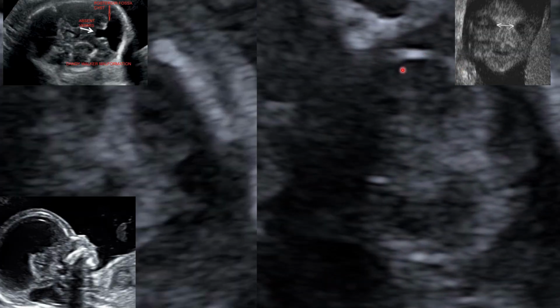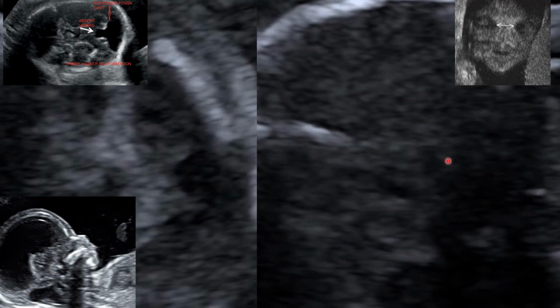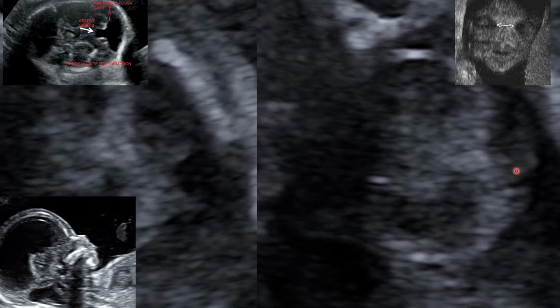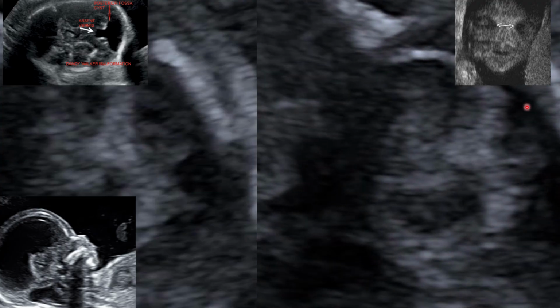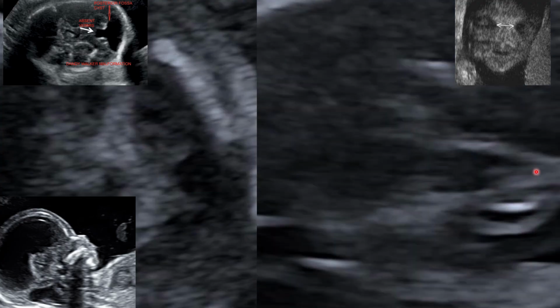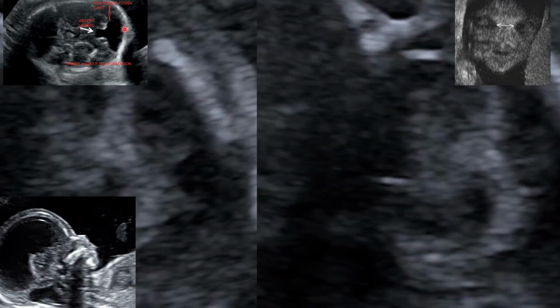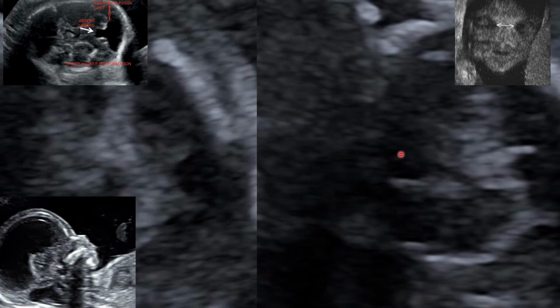This is the zoomed image of the cerebellum. You must make an effort to visualize the cerebellum and then check the fluid at the posterior fossa, the cisterna magna, to see if it's not elevated, with a distance from the occiput to the vermis that is above 10 millimeters.